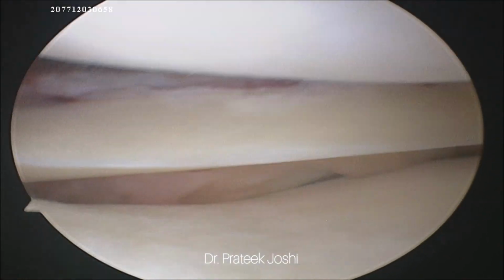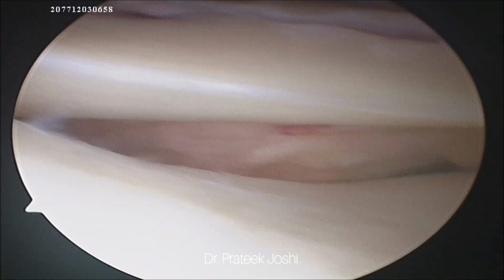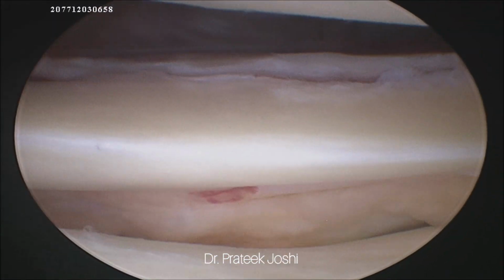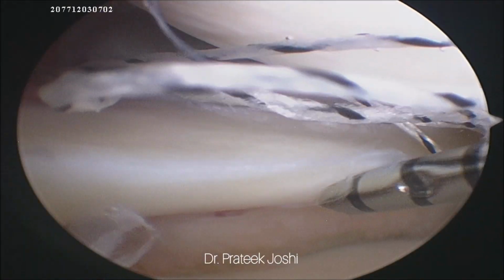And in young age, when we repair the meniscus, we are not removing any part of the meniscus and we are preserving the meniscus, which is going to improve the stress distribution in the knee joint because meniscus is the structure which provides congruent concavo-convex configuration.